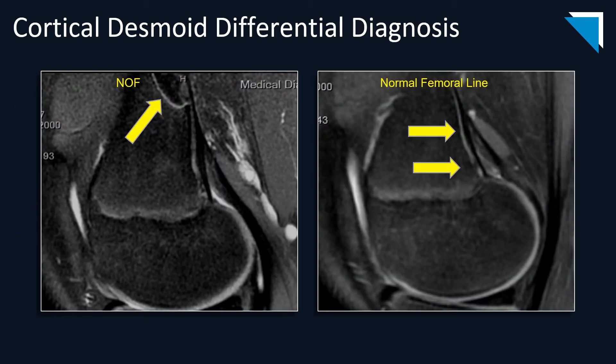On the left, on this sagittal PD fat-saturated image, you can see a non-ossifying fibroma, which is superior to where you would expect a cortical desmoid. On the right, you see a normal femoral line, which is thin hyperintense signal deep to the cortex.